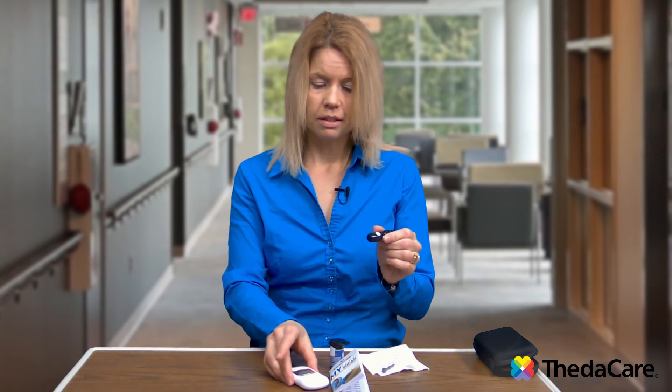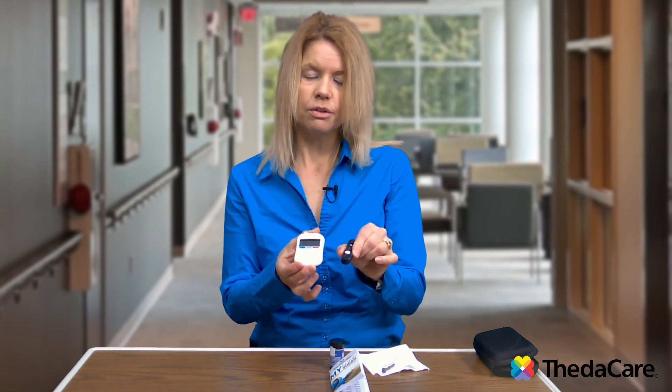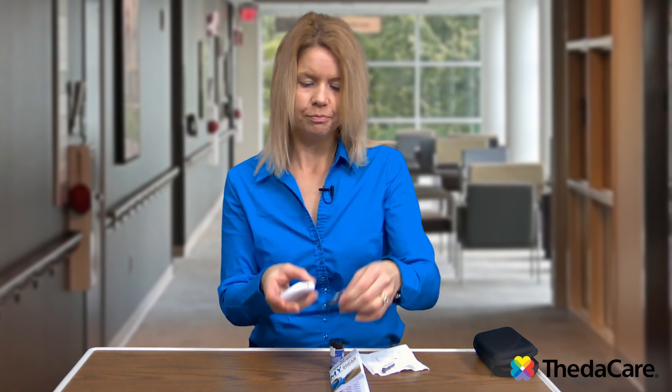And that's how you check your glucose reading. It's very important to do this. I encourage you to get a glucose meter if you do have diabetes, and start checking so you can learn what your glucose readings are and what you need to do to get them in the right range of 80 to 130. Thank you.